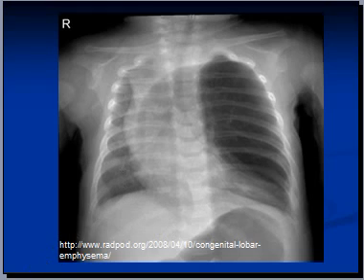There are also signs of compression on the right lung. The condition can cause severe respiratory distress and is caused by weakness or absent bronchial cartilage. Air goes in with each breath and gets trapped in the affected lobe. This should not be mistaken for tension pneumothorax, as insertion of a chest tube will produce negative consequences.